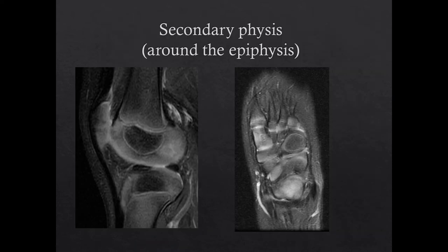There is also a secondary physis, which is a circular structure around the epiphysis with a similar layered appearance, although this is not usually as visible as at the primary physis. The secondary physis allows an epiphysis to enlarge in a circumferential direction. Carpal and tarsal bones are considered epiphyseal equivalents, and also have a circular physis surrounding them, allowing them to enlarge circumferentially.